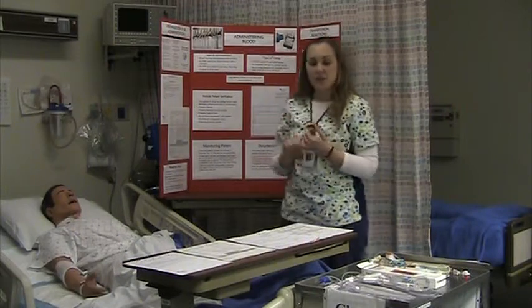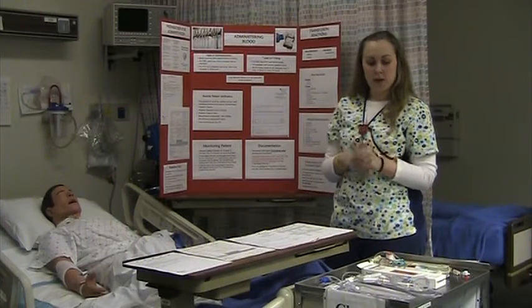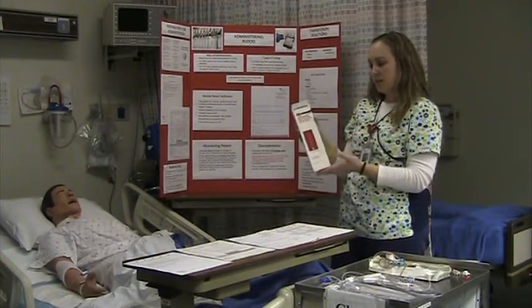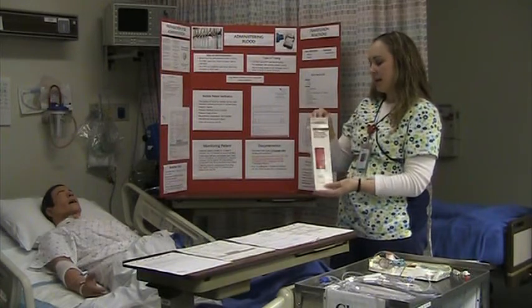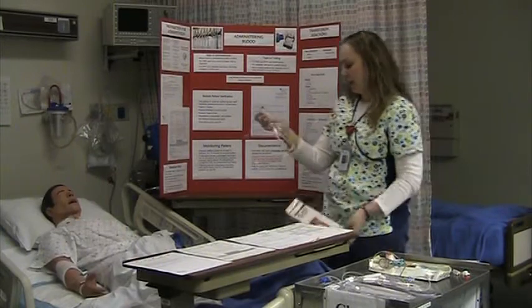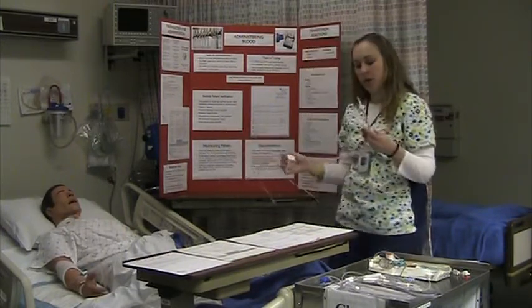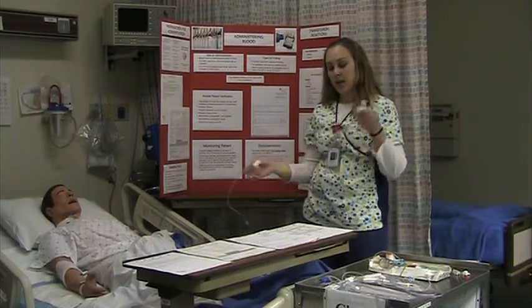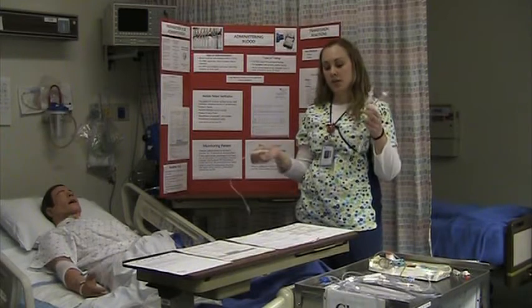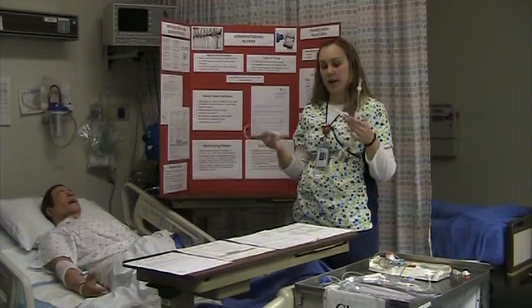So, in reviewing the blood tubing, I just want to go over that. We have a couple different types of tubing. At Valley Care, our platelet tubing comes in this box. I'd like to review that platelet tubing never goes on a pump, and like all blood products, you start slow and then you go as fast as they can tolerate. So with this platelet tubing, you'll see it doesn't go on a pump. You start slow just like everything else, and then you can run it in as fast as they tolerate. Okay?